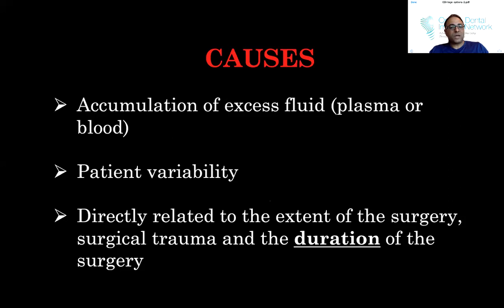It's normally related to the extent of the surgery, meaning the duration of the surgery, but also the extent of the surgical trauma that we're going to induce. So how big are our flaps? And again, to me, I'm okay. I'd rather have more visibility when I'm doing the surgery. And the patient would agree with me that they'd rather have you see more and have a bit more swelling and get a better outcome than you not see as much, have less swelling, but now have a problem.